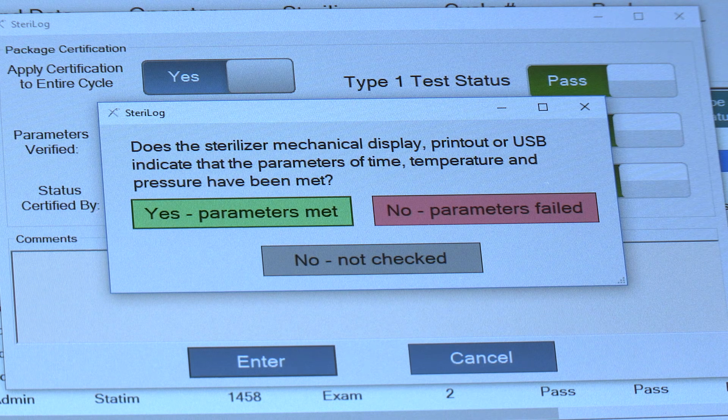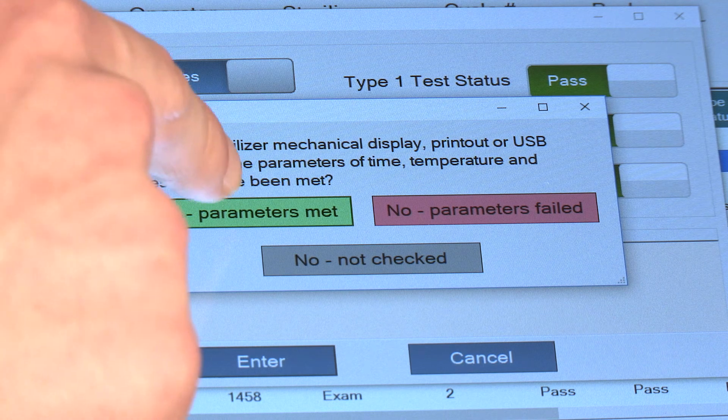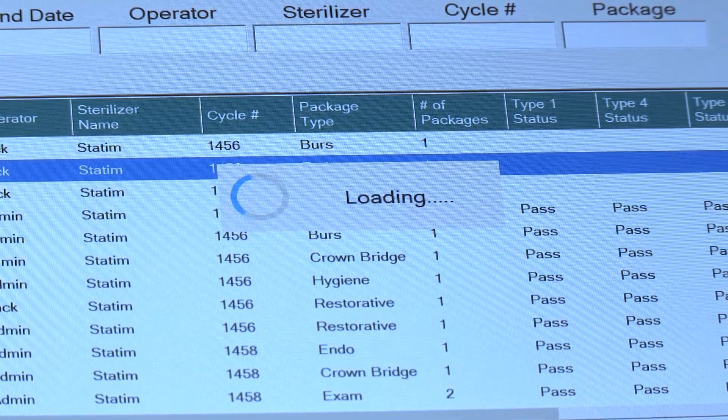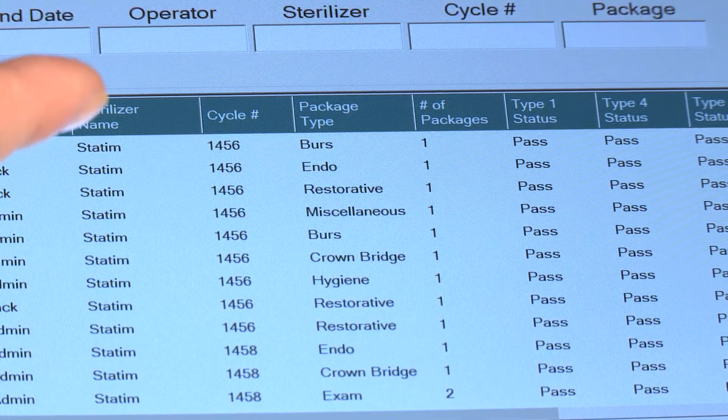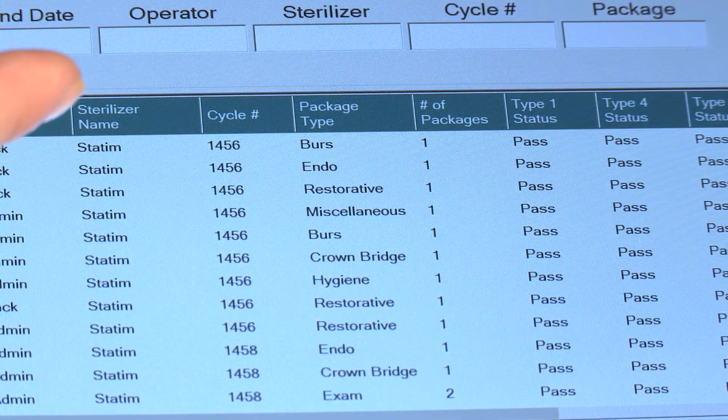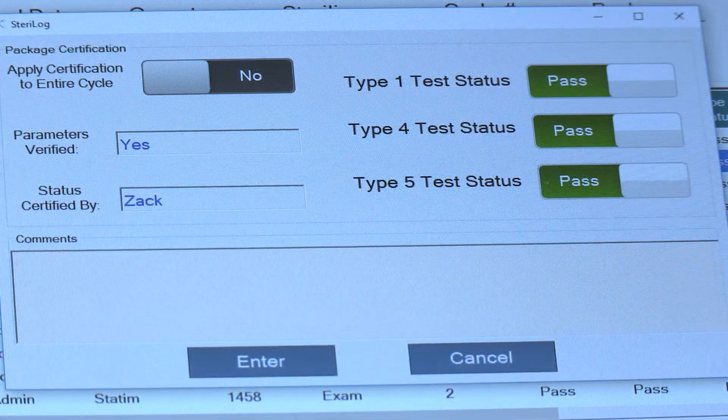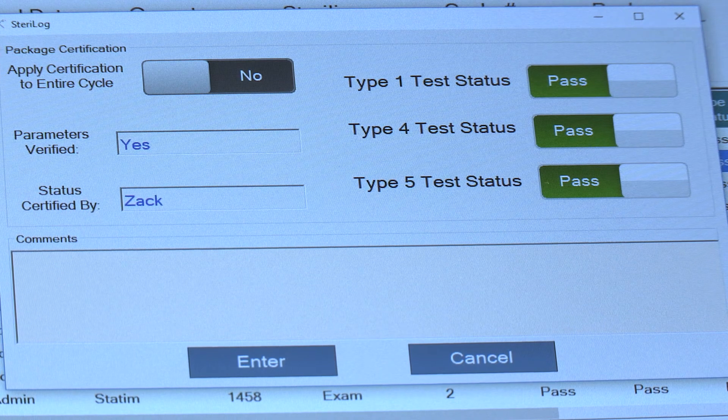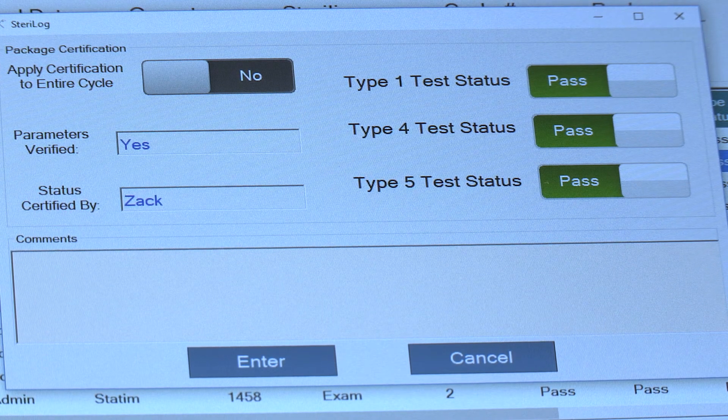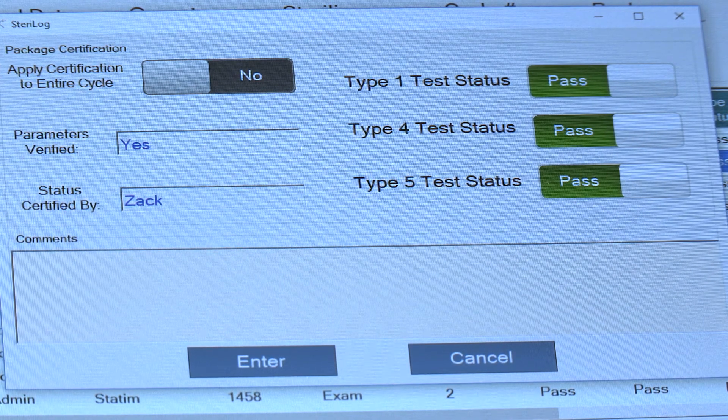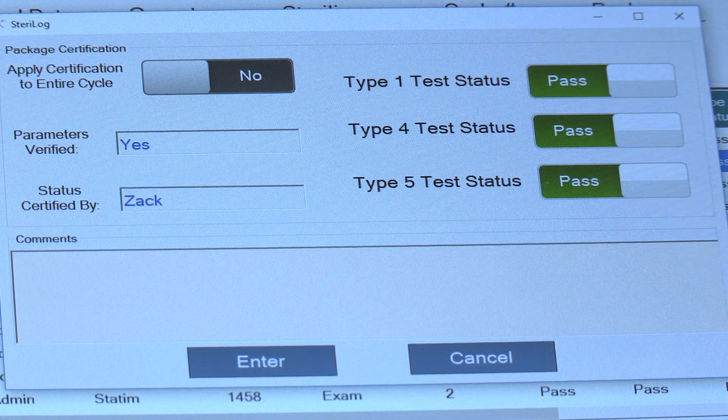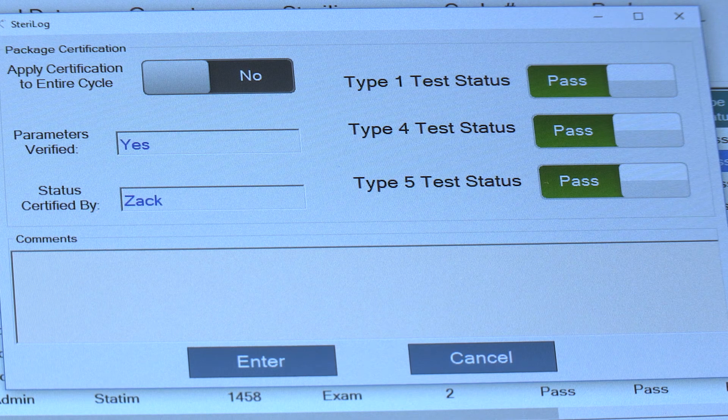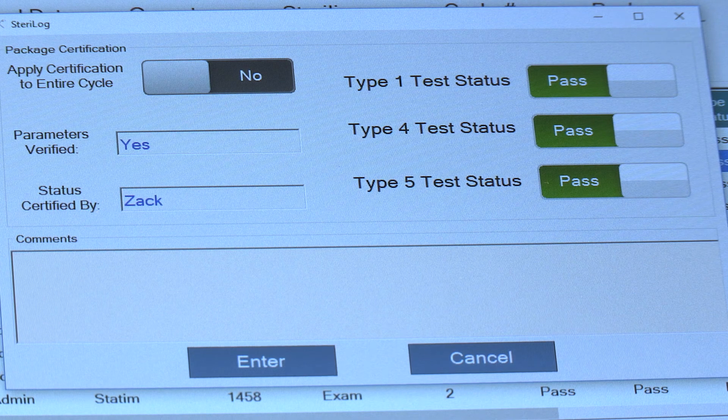If you've done this, you can then hit Yes and you've then certified your cycle. Now if you click on it again, you'll notice that the status was certified by Zach and the parameters were verified. So now these instruments can be released to use.